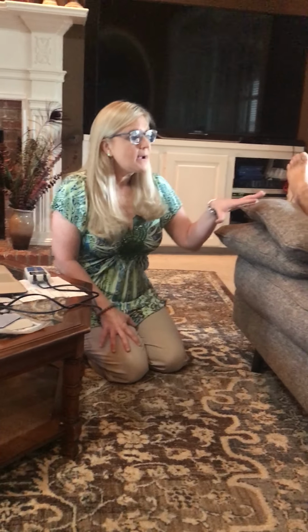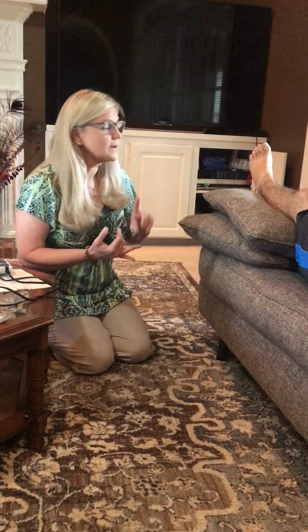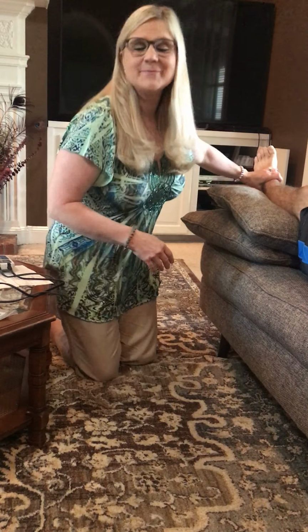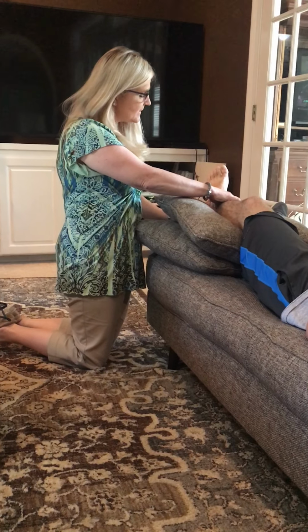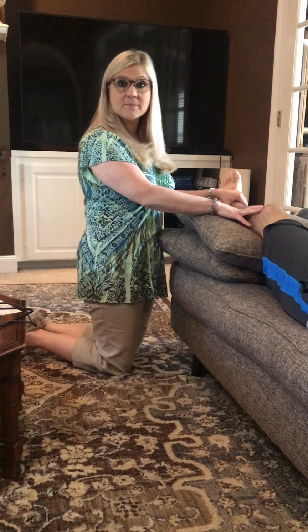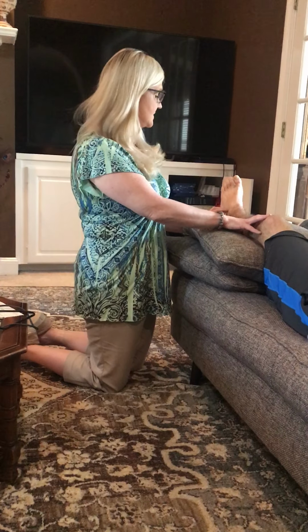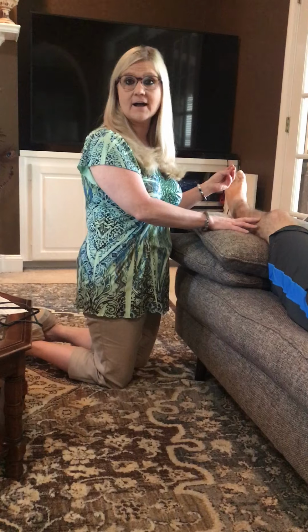All right, so my pre-assessments have all been done. They included the pain scale, goniometry, manual muscle testing, as well as circumferential measurements for edema, skin check, and palpation of the area. He has no contraindications. I went through those with him as well. I explained that it's expected of him to relax throughout the treatment, and it's going to feel like the twitching of the muscle sometimes, and sometimes just that strong sensation feel of the sensory fibers.